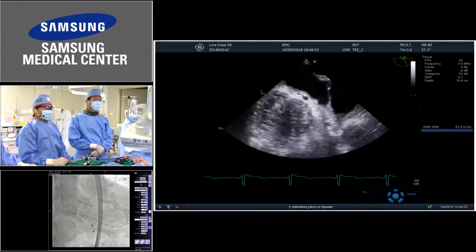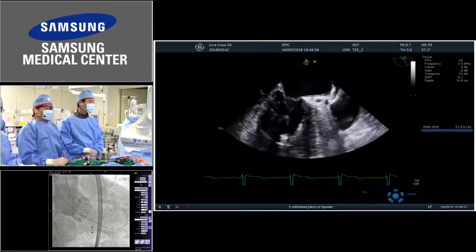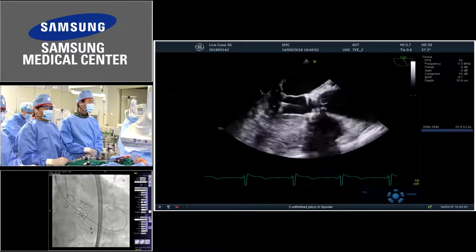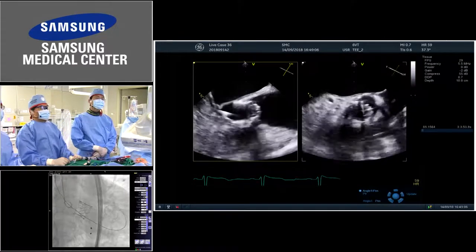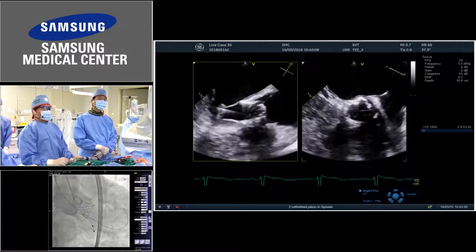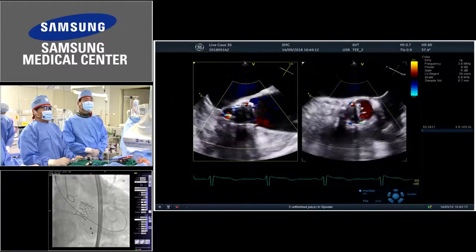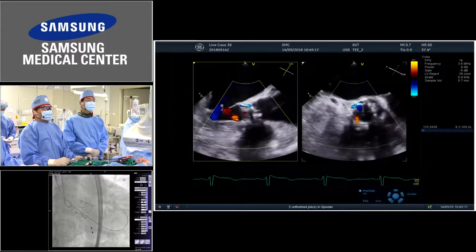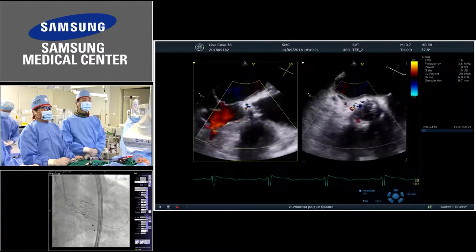The only thing, Dr. Gwon, is that I would be a little bit careful when you park the coronary catheter in the ascending aorta. If you really do have a problem, then it's going to be very difficult to reintubate. So what we usually do is wire it, and then keep the catheter in the ostium or very close to the ostium, so we don't have to go around the wire.